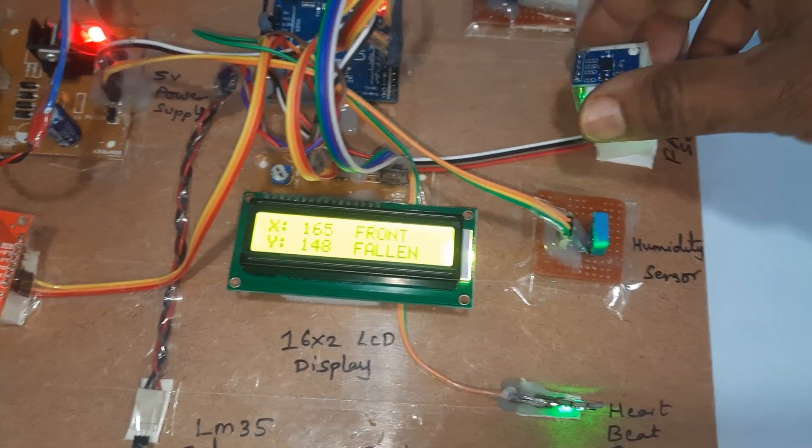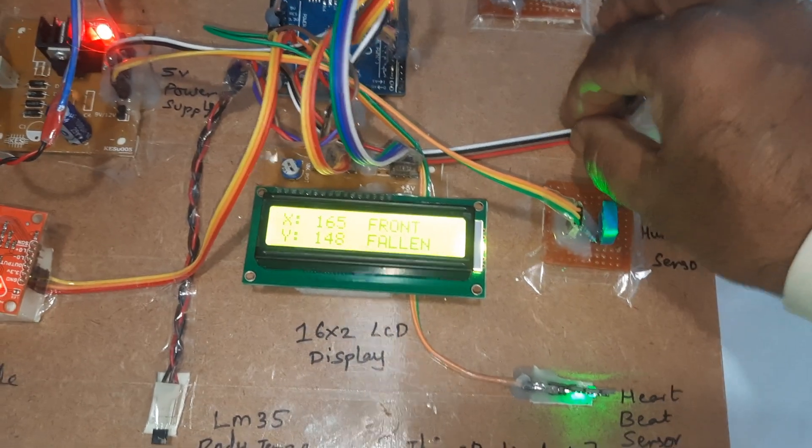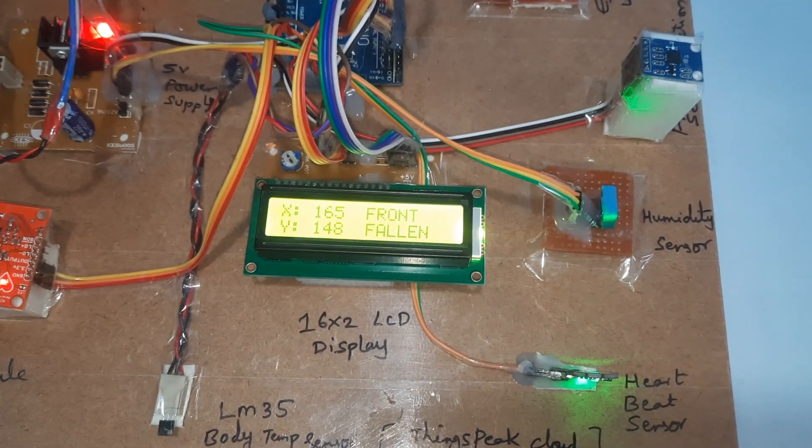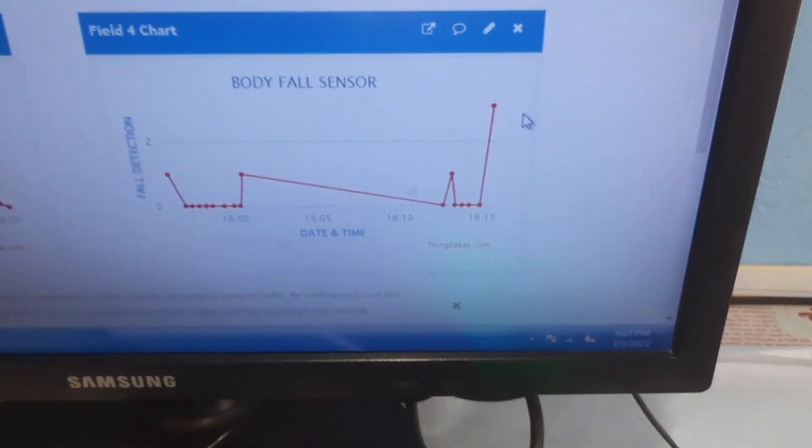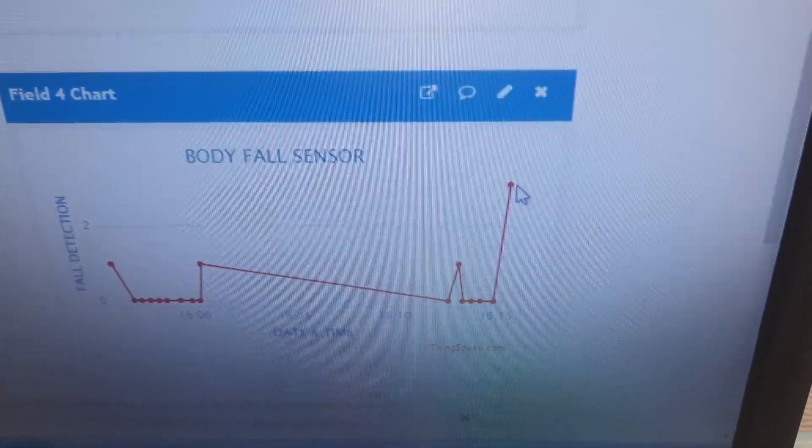Front fallen. Now here we can observe - yeah, front fallen, fall detected.